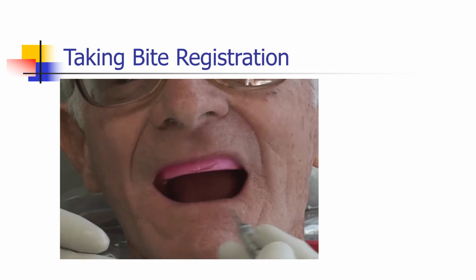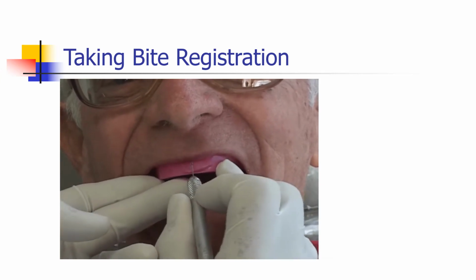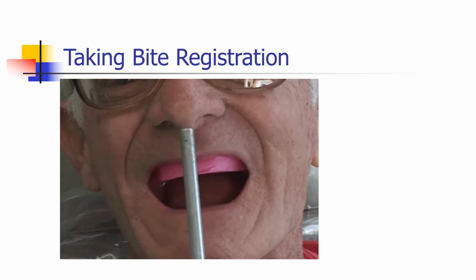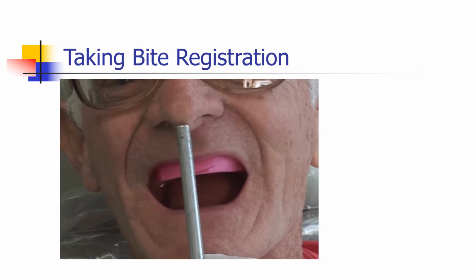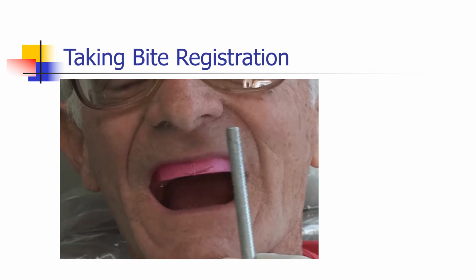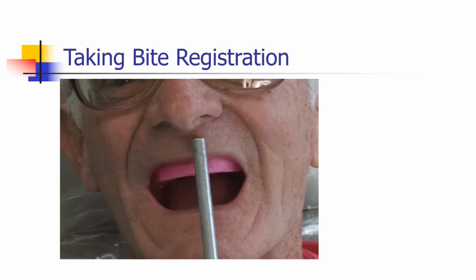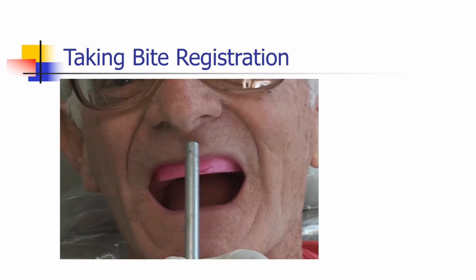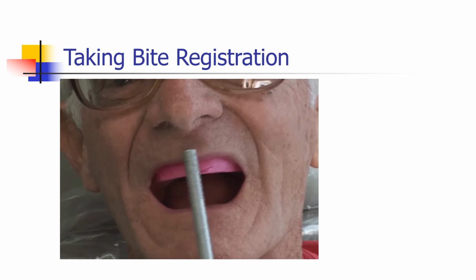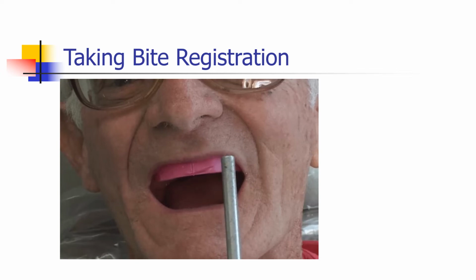When we mark the midline, that gives a technician the angle we call the tip. Tip in orthodontics is this angle here, so it gives the tip of the anterior teeth. It also gives the torque, which in orthodontics is this angle here. So the aesthetic control base gives a tip and a torque of where the final teeth are going to be.